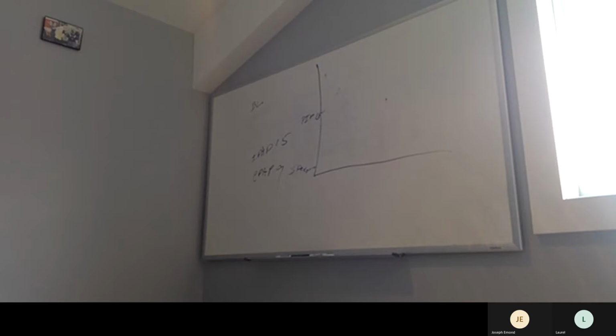And then the next step is, I want you to add some pressure support. I can do 4 of pressure support. So 9 plus 4 will give a peak inspiratory pressure of 13, or a little bit over, right? And then at the bottom, where it says CPAP mode, I want you to change that to bi-level mode. And then in bi-level mode, watch your EPAP and IPAP, and watch how I breathe on that, to see how we do it.